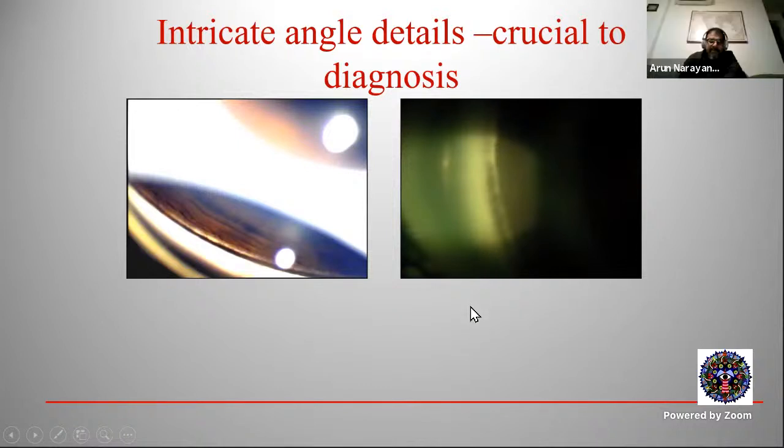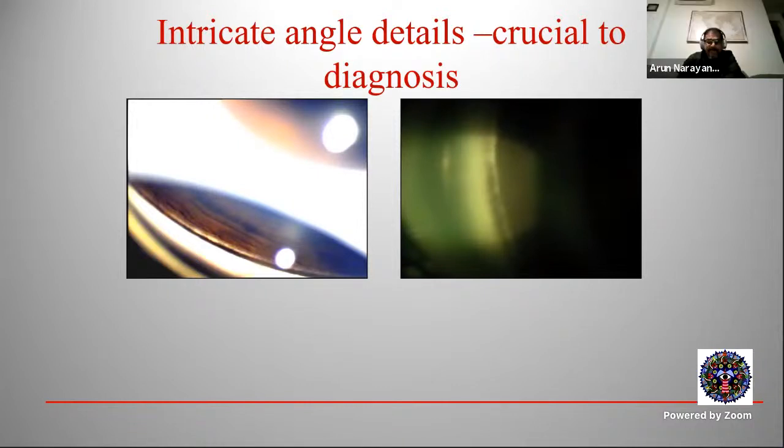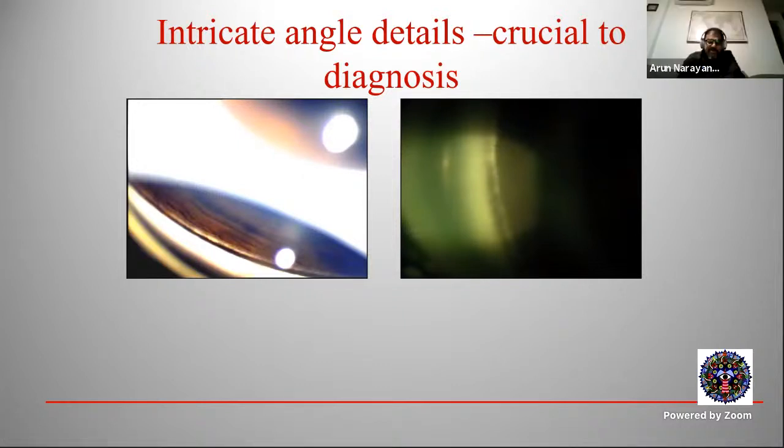Correct. So where do you see such things? Dense, velvety, continuous pigmentation typical of? Sir, pigment dispersion syndrome, sir. Right. And patchy? It can occur in many situations, yes. Uveitis also. Right. Pseudo-exfoliation. Right.